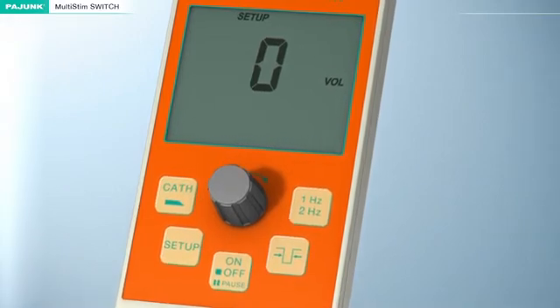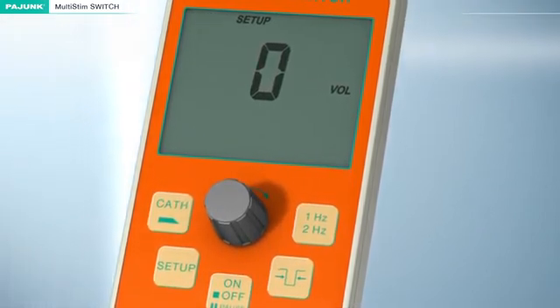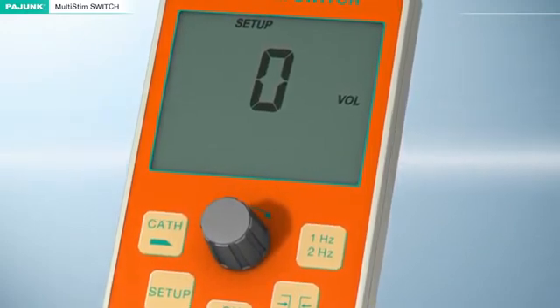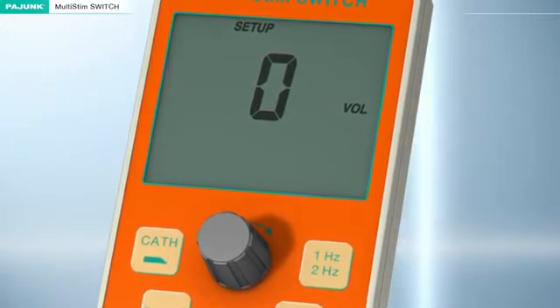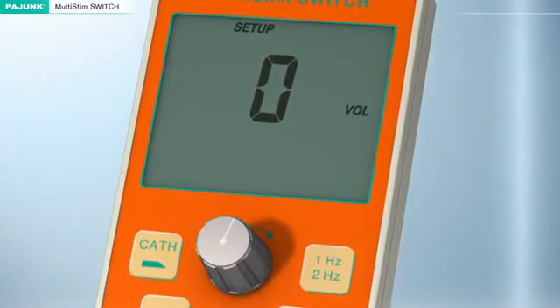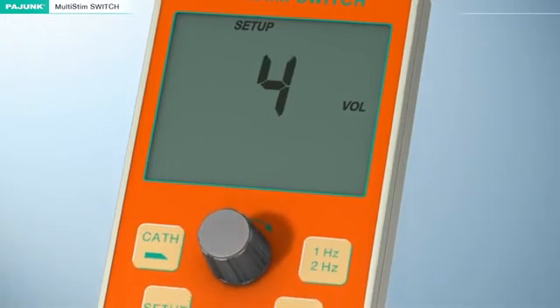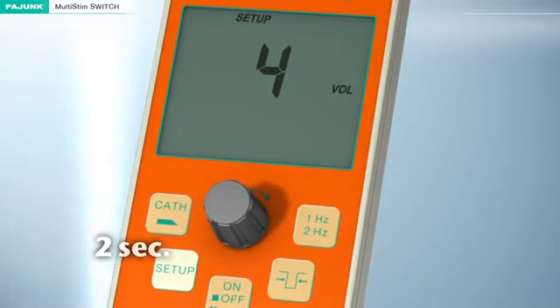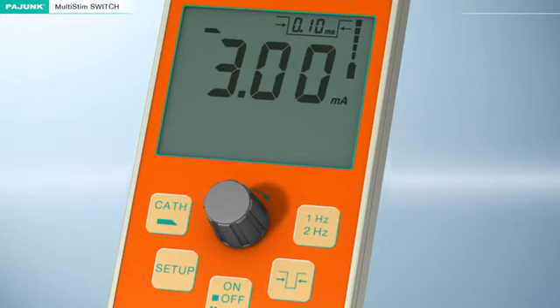Setup Level 1: The volume of the warning and monitoring sounds can be adjusted in level 1. The scale ranges from 0 (monitoring and warning sounds turned off) to 4 (very loud). The adjustment is carried out by turning the knob. The setup button must be pressed for at least 2 seconds to store the selected value permanently. A monitoring sound will be emitted upon successful storage, then the device will switch to pause mode automatically.